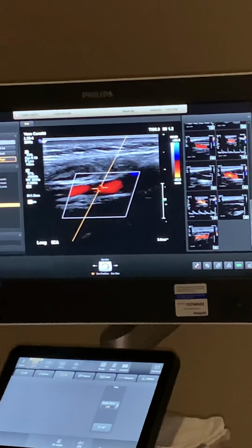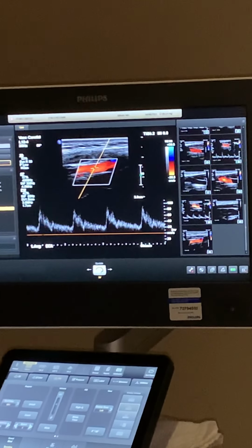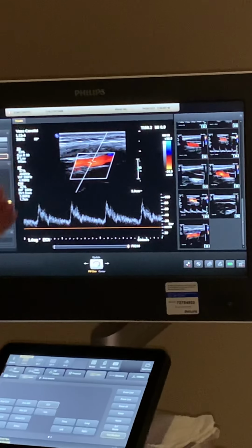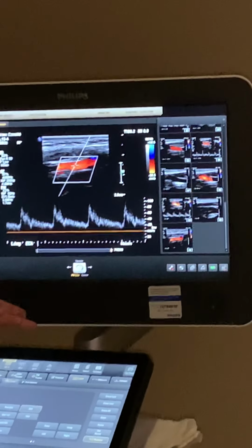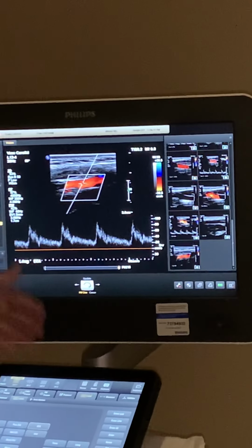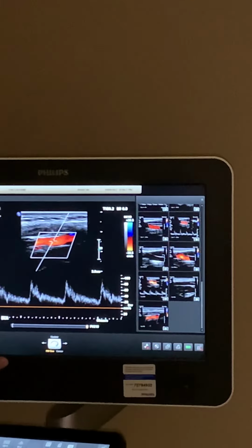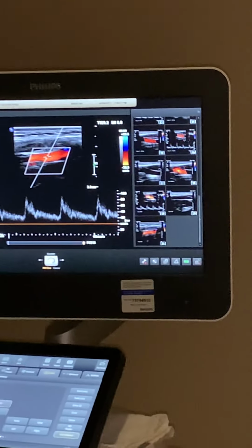Vessel open, proximal segment. Alright, on the ECA here we have a sharp peak systolic. You'll see when we do the ICA, this diastolic. Now, in some of the patients that you'll do, like in the clinic settings in the hospitals, they're not generally the healthiest of people. So you may not get any diastolic flow at all. You may just get a real sharp peak systolic and very little to no diastolic flow. But this is going to show more of a higher resistive flow. So when we do the ICA, you'll see that this diastolic velocity should be a little bit higher.